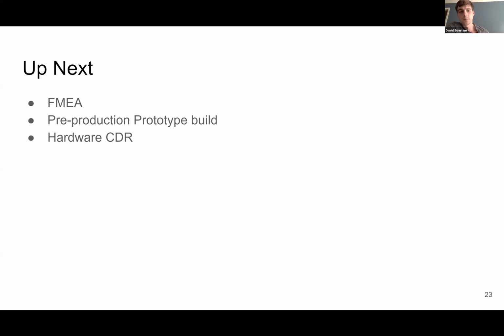So if you have something that's specific to the design, like a failure mode, just send that out or make a comment in the current FMEA. If you identify something like an overall hazard with the device, like it could harbor some infection or something like that that isn't necessarily a design failure mode, let me know and I'll add that to the overall risk assessment of the device.